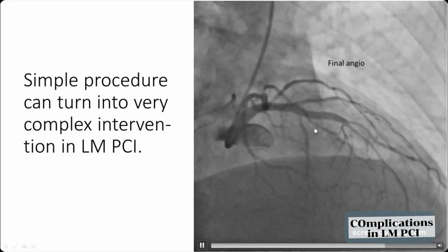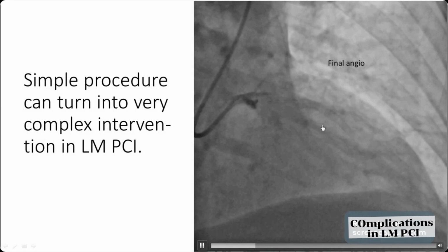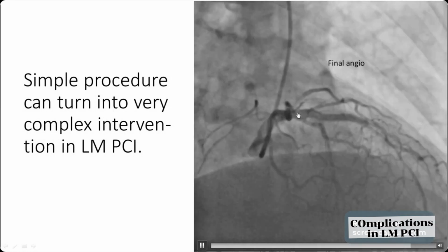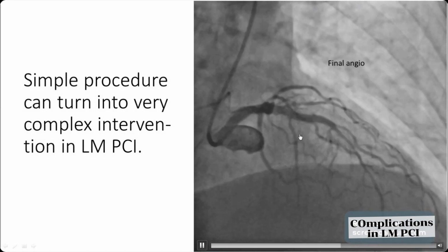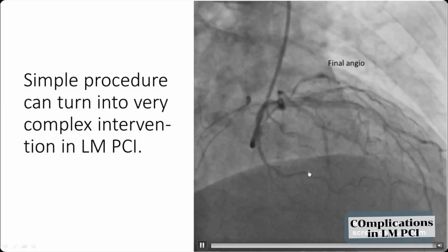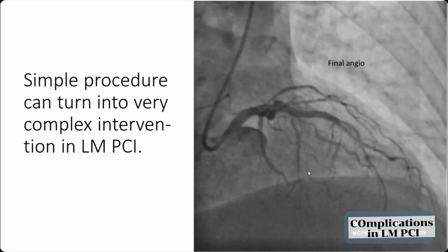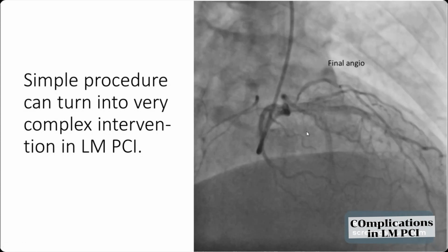This is the final angio from another view. There is no thrombus in the LAD and circumflex. But don't forget, a simple procedure can turn into a very complex intervention in left main PCI.